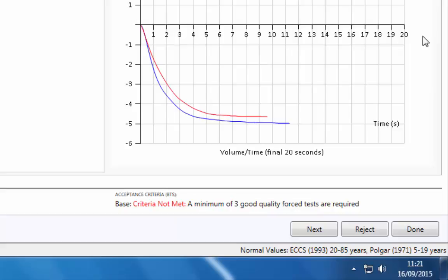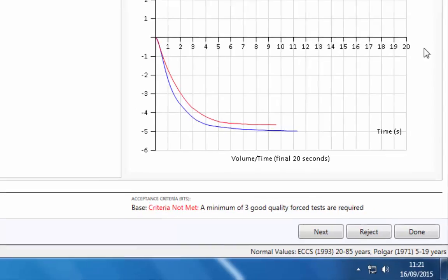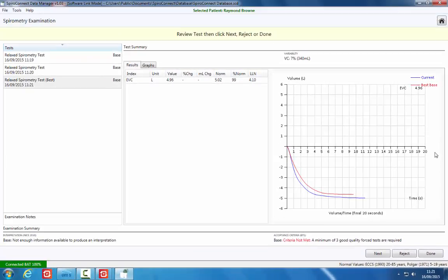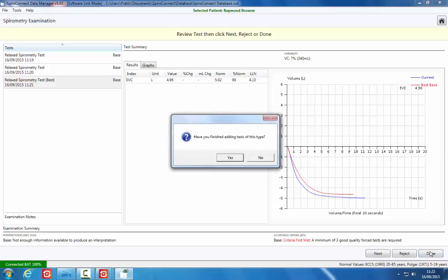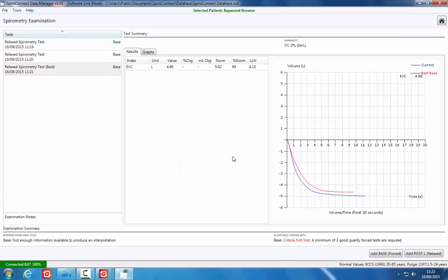When sufficient blows have been performed, click the Done button. A confirmation message will appear. Click Yes to confirm that you have finished adding relaxed tests, or click No if you decide that you wish to perform more relaxed tests.